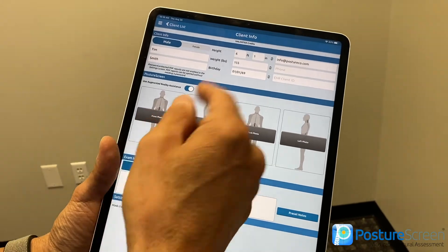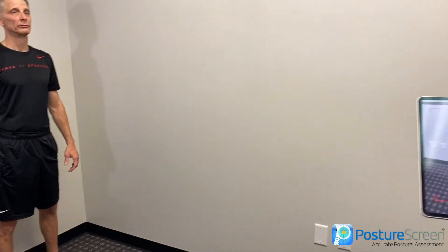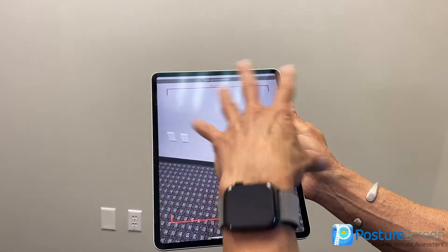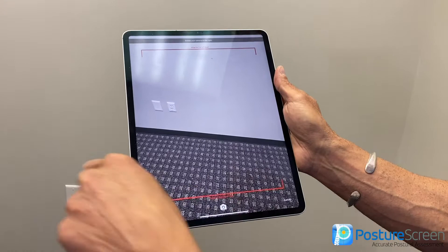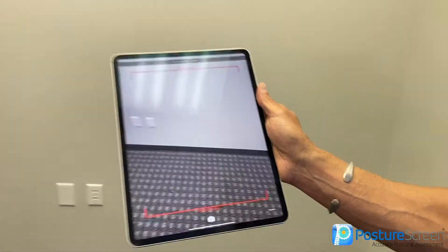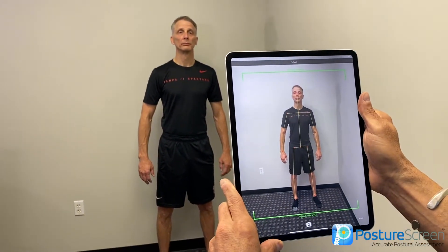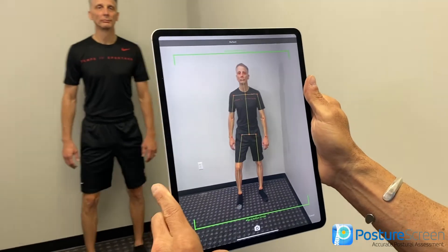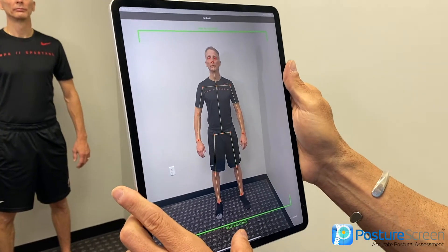I'm going to click here and then get on the other side of the camera. As I point the device, notice we have these horizontal lines. For best practices, if you can get those to turn green — and notice if you have baseboards, try to keep it horizontal if you can. As soon as we come in here, notice that it tracked the person automatically. See how it tracks efficiently? Once he's in his neutral resting posture, you're just going to hit the camera.